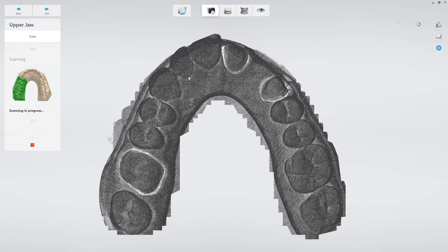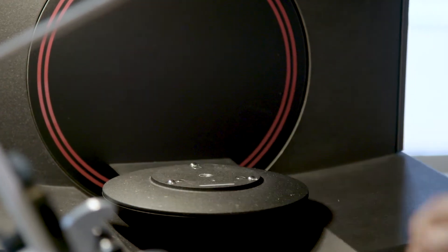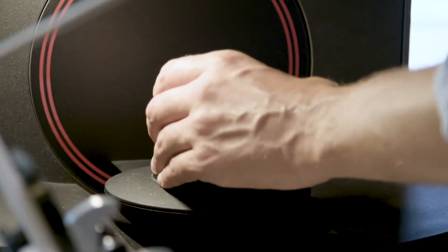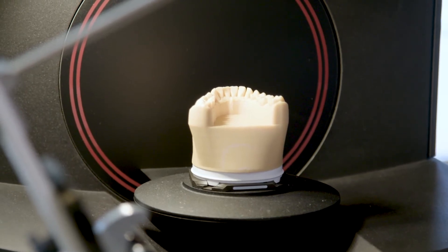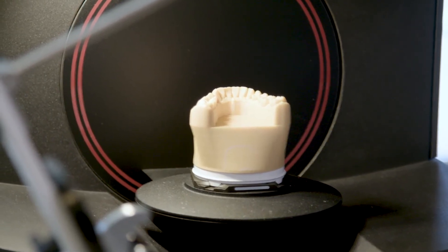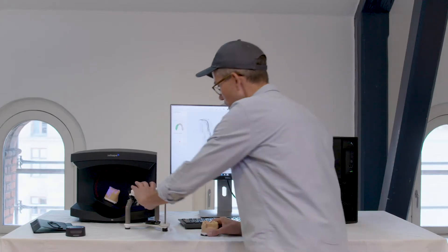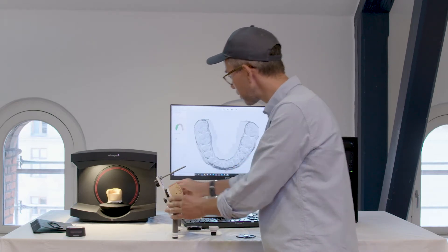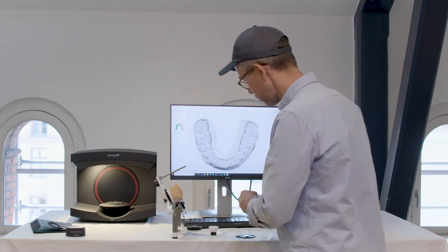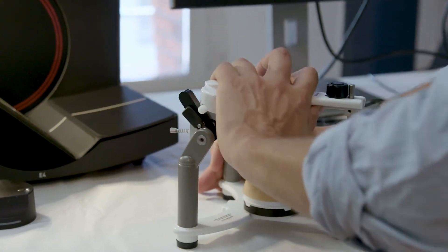Now I have this one post-processing. I'm going to take this away and place the next one. In the meantime, I'll start trimming my prep model. Then I can actually start placing my models into the articulator. I'll remove my antagonist and get them into a registration.